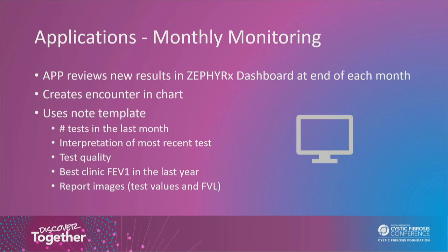Now Laura Beth will discuss our monthly monitoring of the home spirometer results.